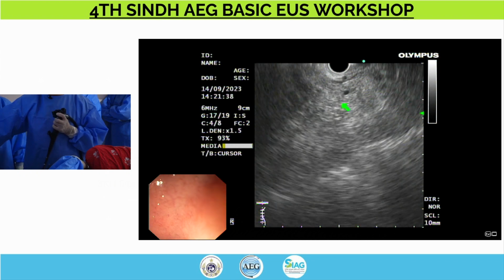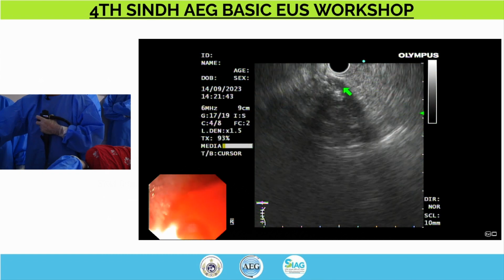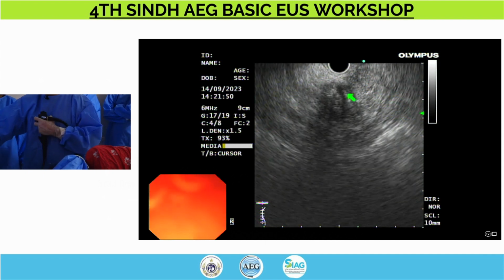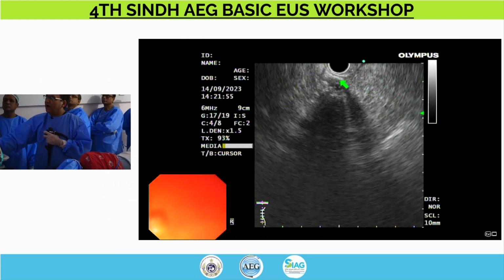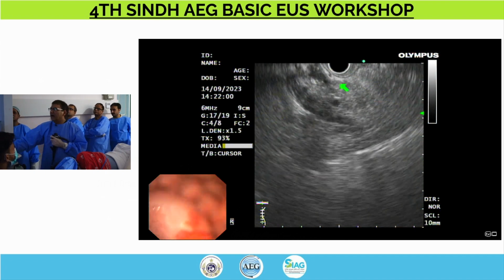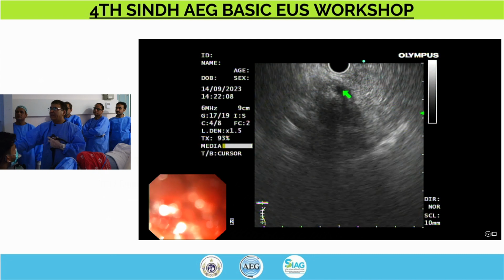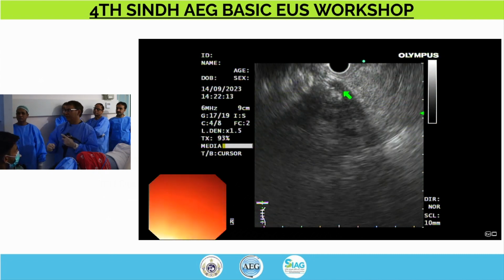But I think we are able to get at least a good view of the pancreas, and I don't see any major abnormality. It's hard to appreciate stricture in this area. The reason for that is there's too much shadowing there. There may be a little bit of thickening of the wall, but I don't see anything bad in there. I don't see a mass there, at least not an obvious mass. So I think she had the stones, she keeps passing those stones. There may be an inflammatory process leading to the thickness of the bile duct.